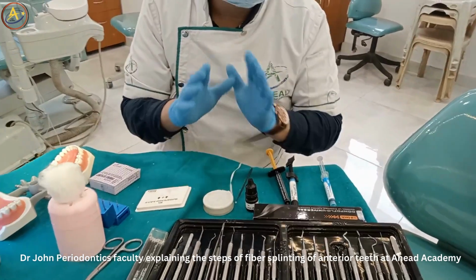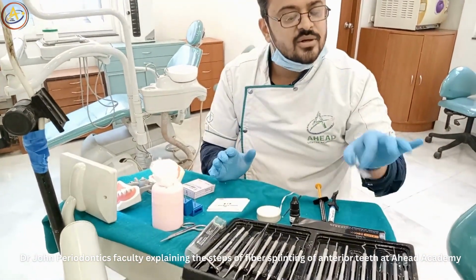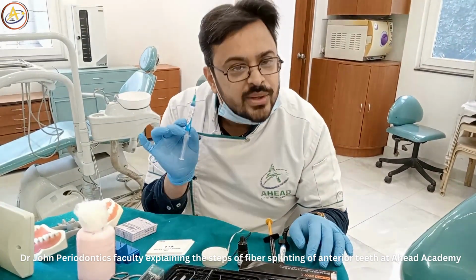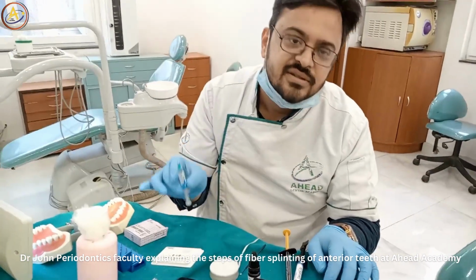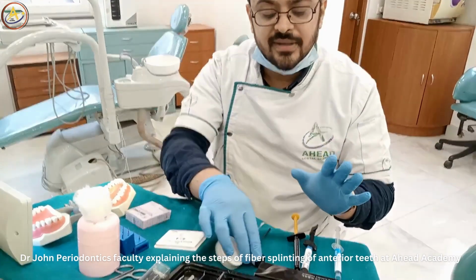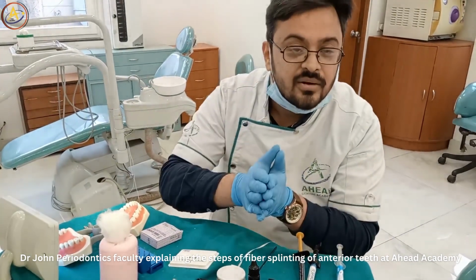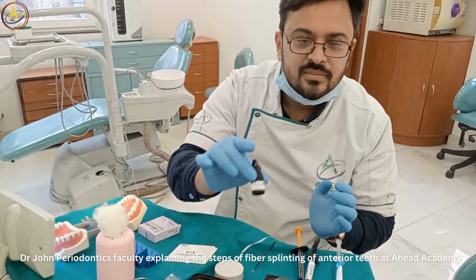Now always remember, if you go by protocol, your treatment procedure will never fail. Etchant is required whenever you use a composite material, so that it removes the smear layer. It is applied for at least 20 seconds, and then you clean that with a water or air wash syringe, the 3-way syringe. Okay. Then you have the bonding agent. The bonding agent is required basically so that the bond between the composite and the tooth is greatly enhanced. You need something to bond. So the bond between the tooth and the composite is achieved with the help of this bonding agent.